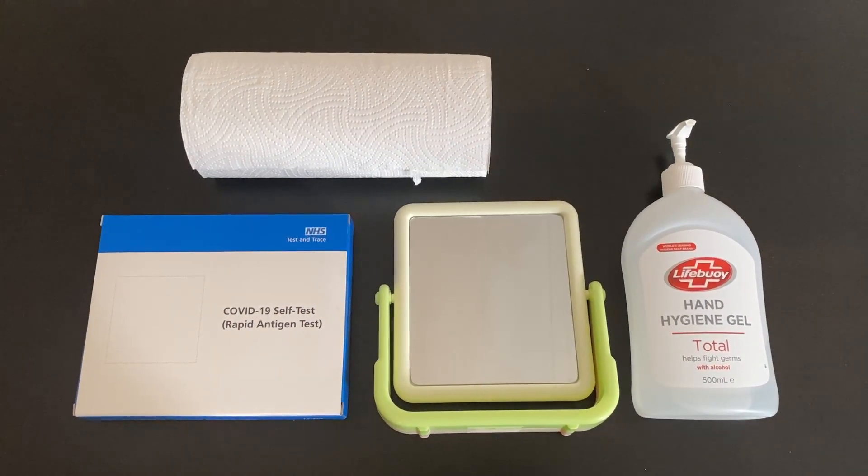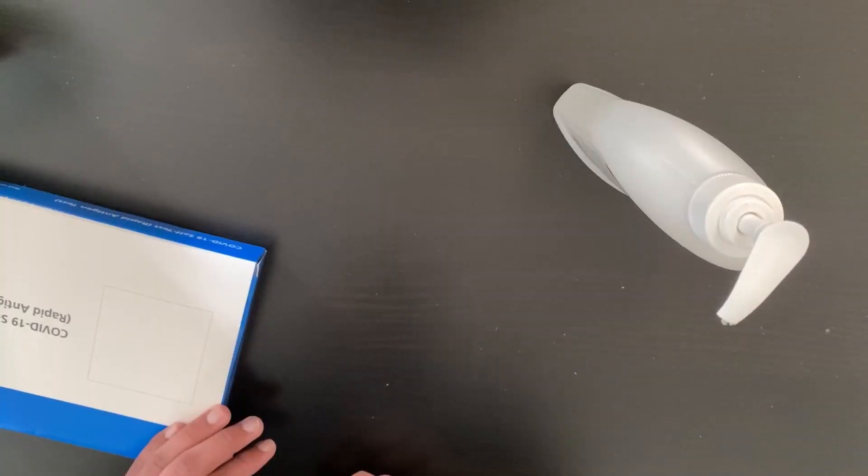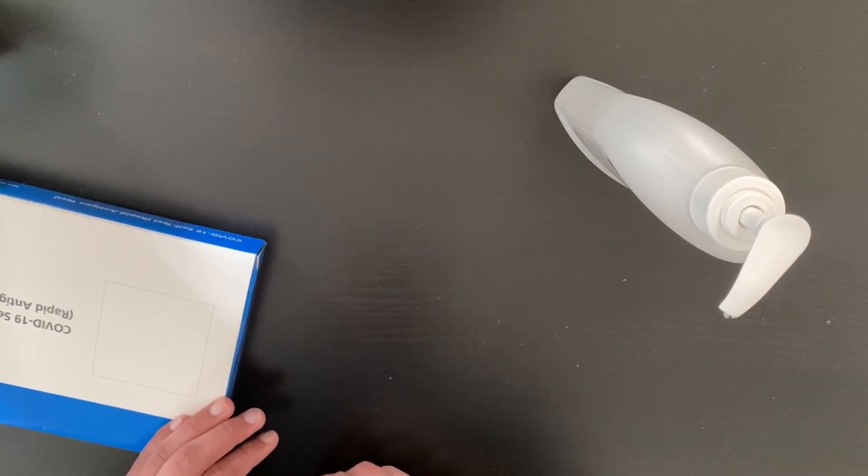Before we start, ensure that you have a clean and disinfected surface. The first thing we need to do is sanitize our hands.